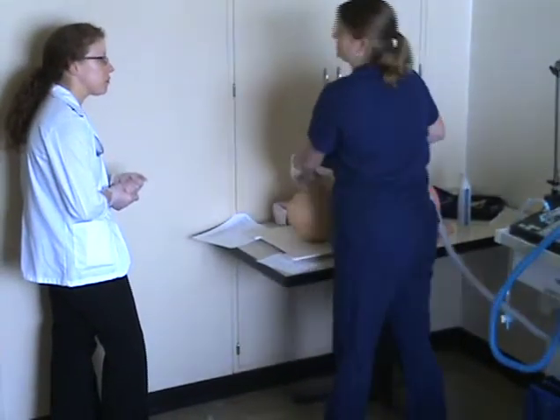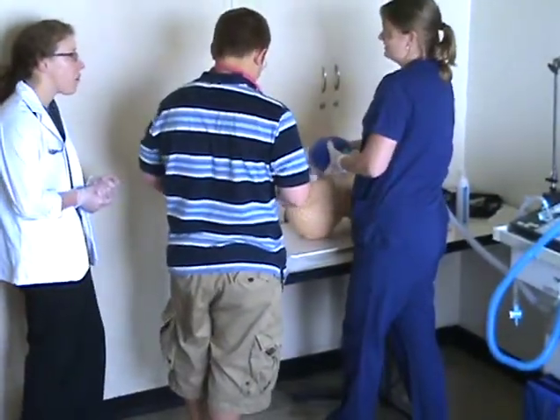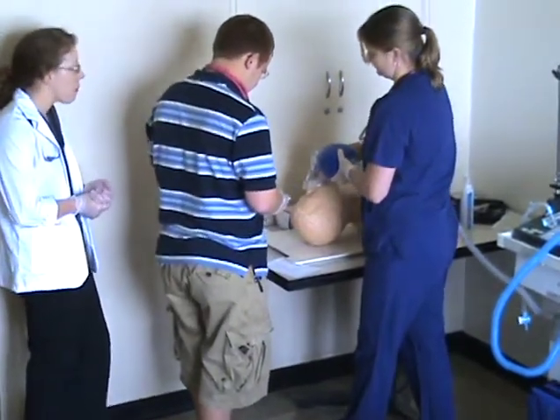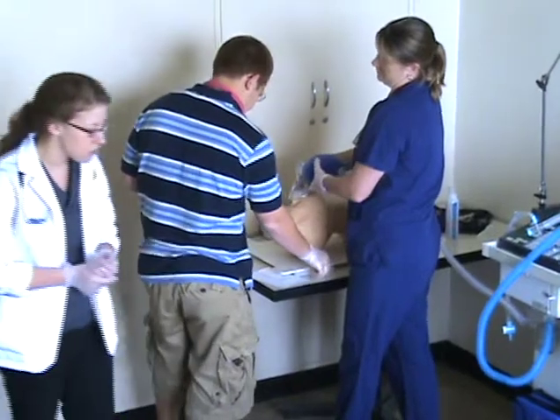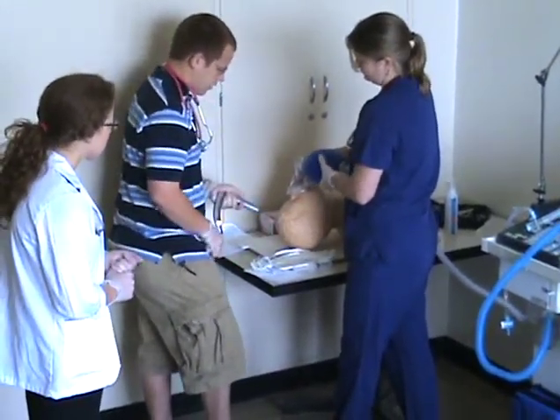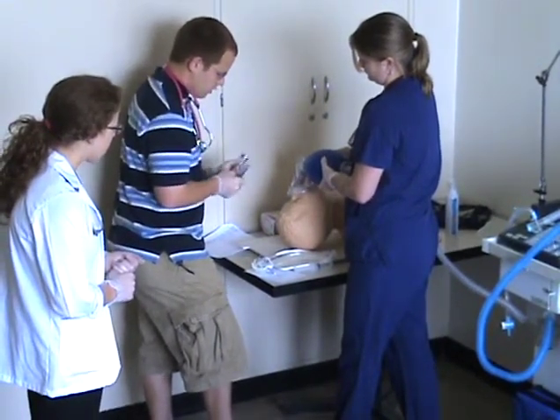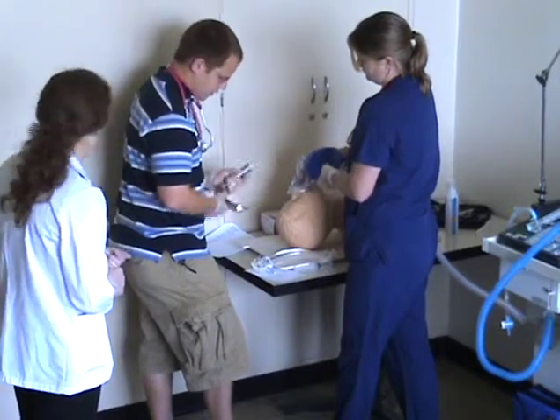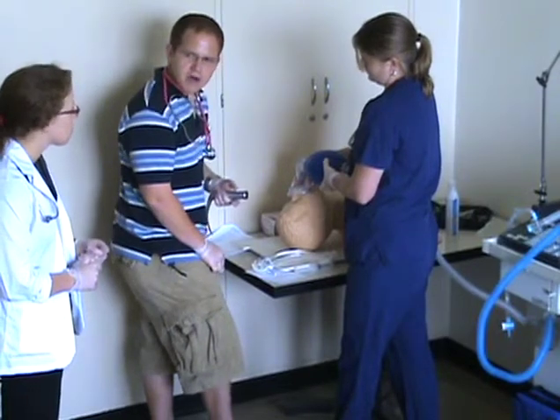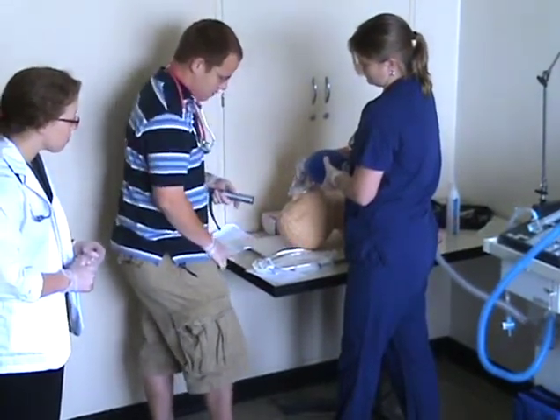Make sure he's oxygenated, and on intubation, only give them about 30 seconds to intubate. If they don't get it in, they need to pull out so we can rebag. You want to watch the monitor and make sure the O2 sats are decent. For an adult male, I would ideally use a size 3 laryngoscope blade. I would make sure the blade is working sufficiently, good battery, good light. I would probably use a size 8 to 8.5 endotracheal tube, and I have my syringe ready.